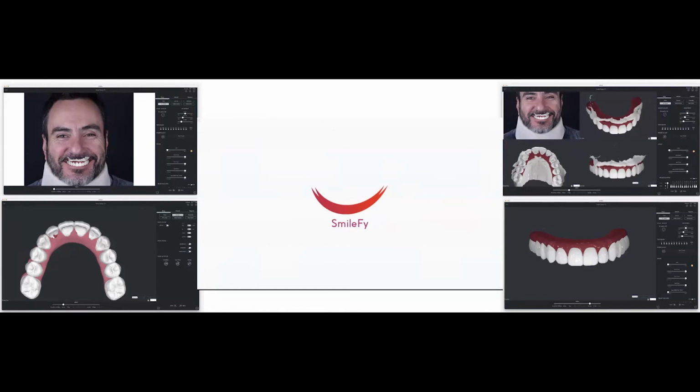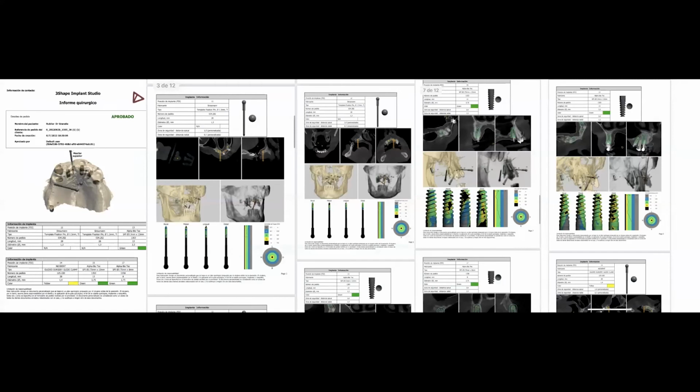Now I don't have a camera, okay? Don't worry. This is the treatment for Marcelo. I have all the guides here, and maybe this week I will make the surgery.